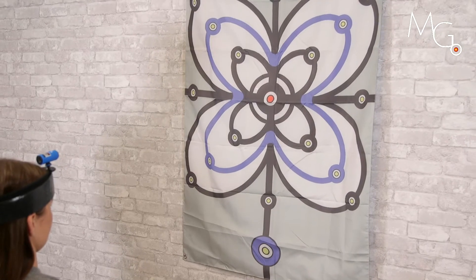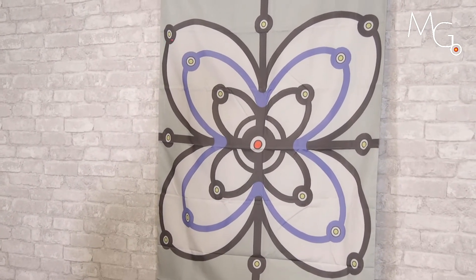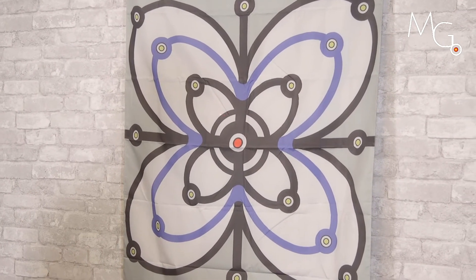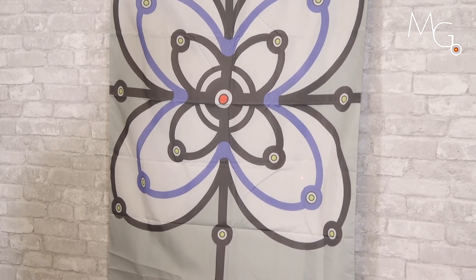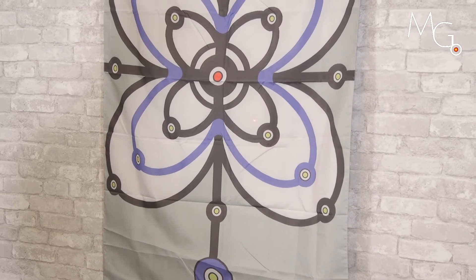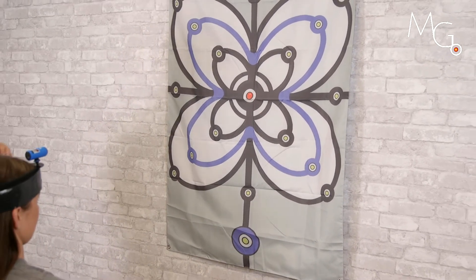Notice unwanted or abnormal movements. We can work on speed as well as different shapes.